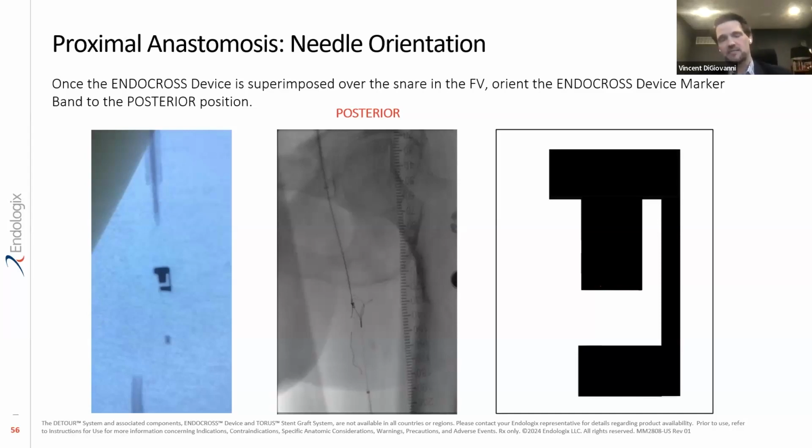When you go in there, from my standpoint, I want to know that I have a minimum of 10 millimeter vein or a duplicate system. And I go in there and I'm like, listen, I know what I'm going to do. And I've seen times when you've had contrast hold up and then you squeeze the calf and things move through it. But what are you going to do if you do a venogram and you see contrast hold up to the point that you're worried that, okay, this guy's headed for DVT? What are you going to do then?